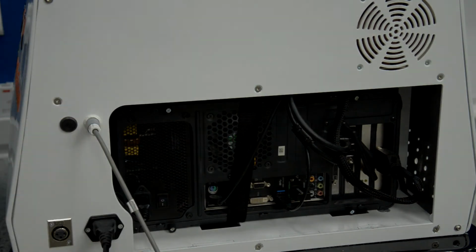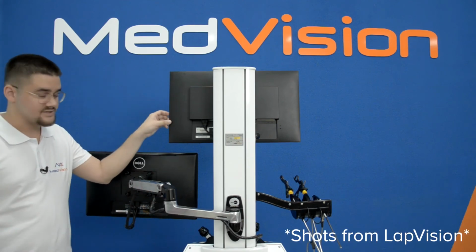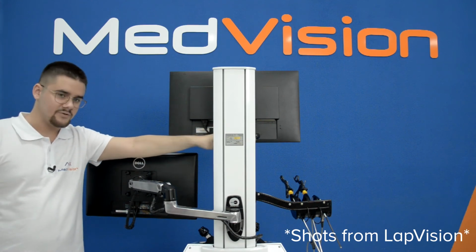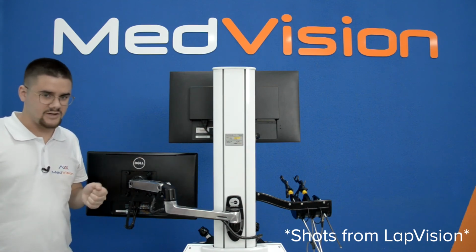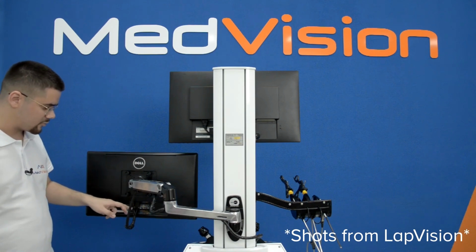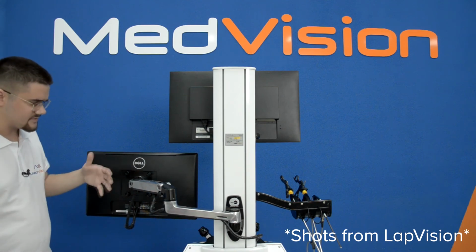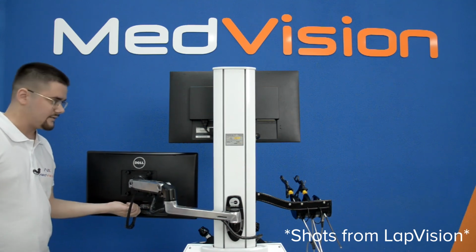As easy as that. A couple of words about monitor connections. So the main monitor, which is non-touch screen, is connected classically with two cables, one of which is power cable and the other one is the video interface. In this case, it's HDMI, but it can be a DisplayPort, DVI, or VGA connector. However, when it comes to the touchscreen monitor, it's always three cables, one of which is USB-B, which is responsible exactly for the touch input. So a common problem when something stops working, just plug them in more firmly back together and that's it.